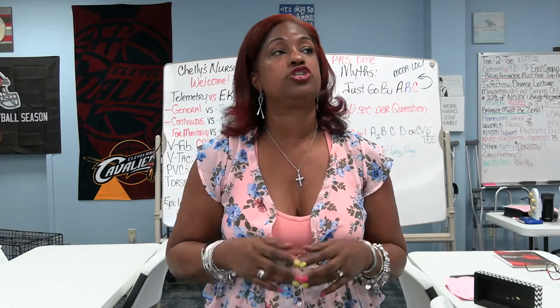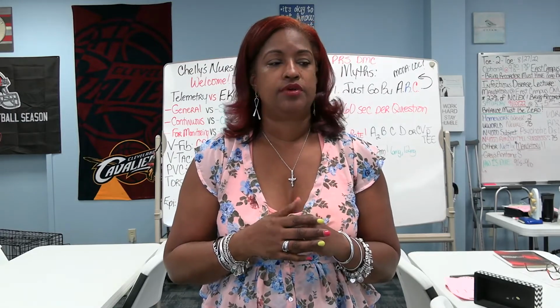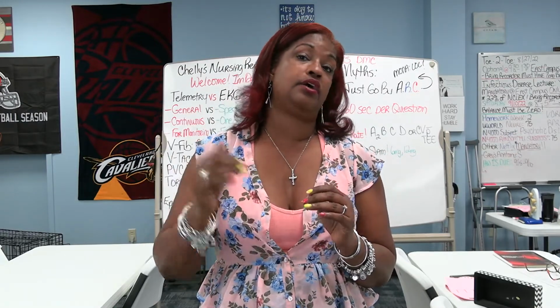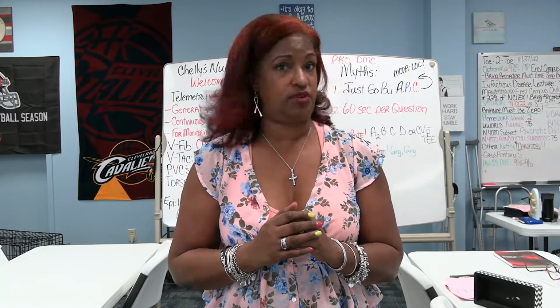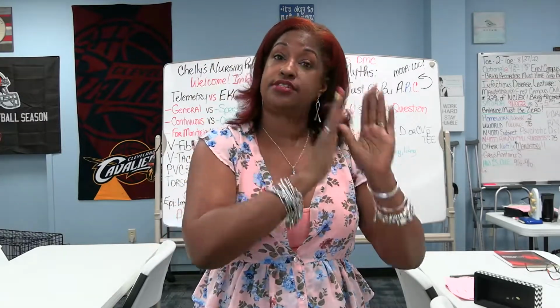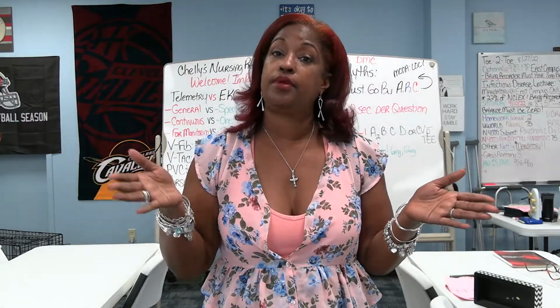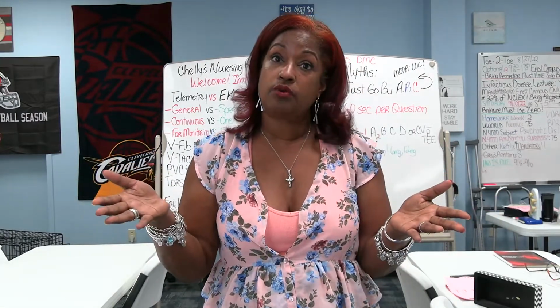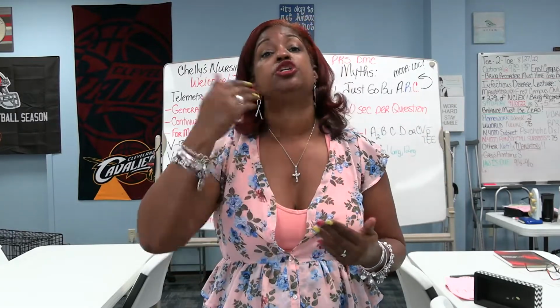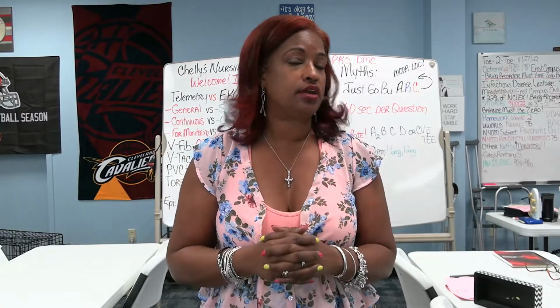And I would caution you to understand a little bit more about tachy rates. I would say a heart rate 110 and higher makes us a little nervous, shall we say, because there's got to be something really, really wrong with why that heart rate is that high. But you get it. We're talking basics here. We're talking P, Q, R, S, T, right? And we're talking what's the normal heart rate if you're going to look at the rate early in the basic process. What's the normal heart rate? Well, the normal heart rate is 60 to 100. And so going all outside of that range is going to make us kind of nervous.